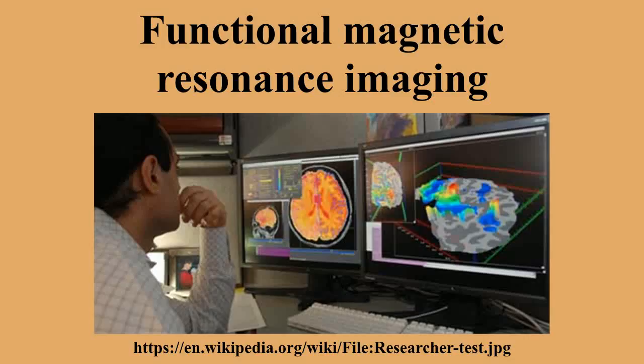Oxygen is carried by the hemoglobin molecule in red blood cells. Deoxygenated hemoglobin is more magnetic than oxygenated hemoglobin, which is virtually resistant to magnetism. This difference leads to an improved MR signal since the diamagnetic blood interferes with the magnetic MR signal less. This improvement can be mapped to show which neurons are active at a time.